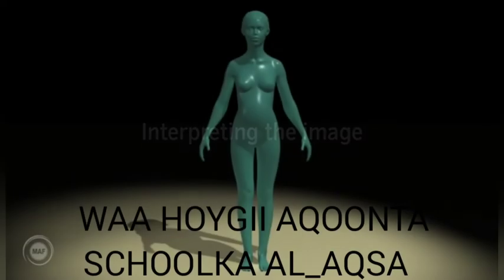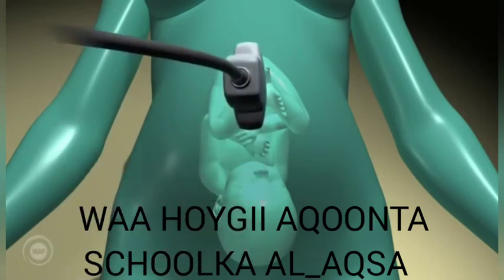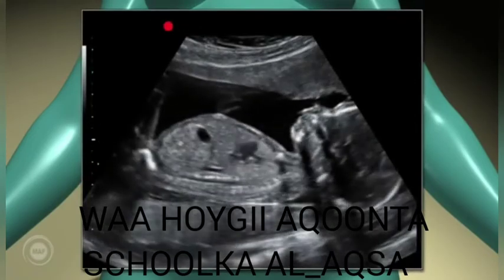Interpreting the image. There are various positions of the back for cephalic or breech presentation. Cephalic, back posterior. Scanning in the longitudinal plane, the fetus's back is lying along the mother's back. They are back to back. The head will appear to the right of the screen, and its back will be on the lower part of the screen.